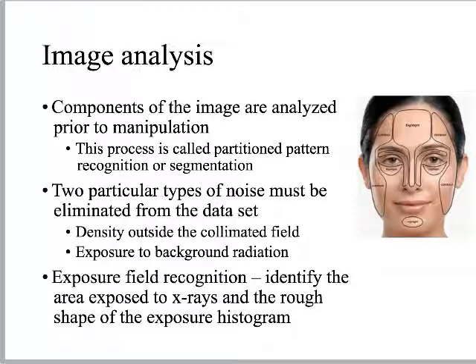But we have to think about this as analyzing every single component of the image data, of this raw data, prior to the manipulation. So knowing, okay, I'm looking at a chest, for example, chest x-ray, and the computer says, okay, this is what I expect to see.